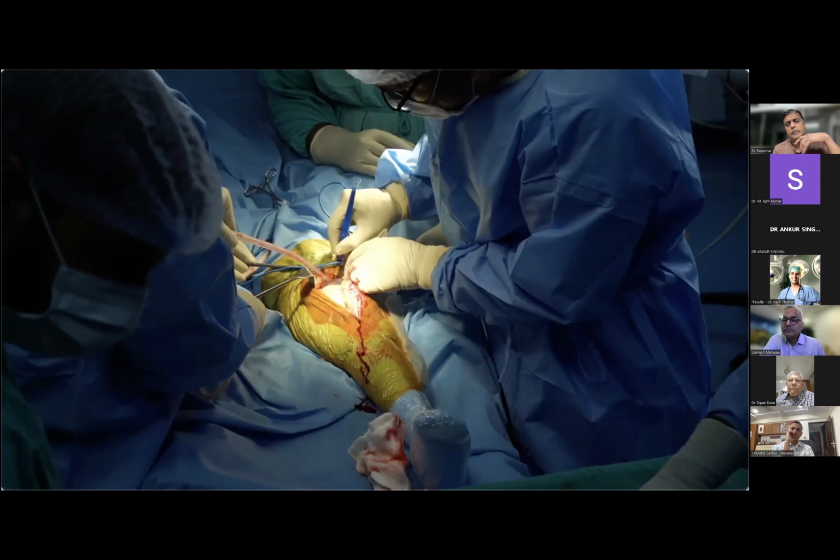So I'm going to ask one question to all the faculty. Has anyone actually ever used the same extracted femoral and tibial component, autoclaved it and reused it as a spacer? I've been using it autoclaved for years, and it works very well. Even we use it quite frequently. I use an RP insert. RP insert is good for the tibia. Just put an RP insert on the cement, a loose cement, and it works very well for an articulating spacer.